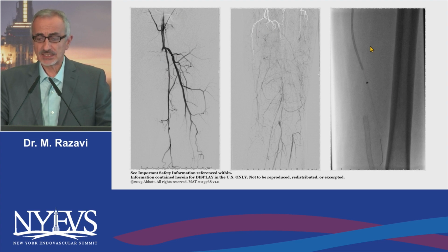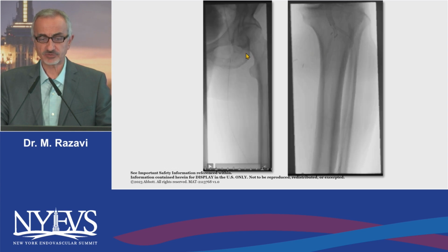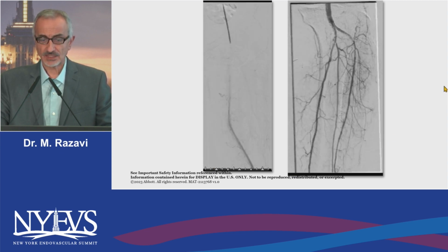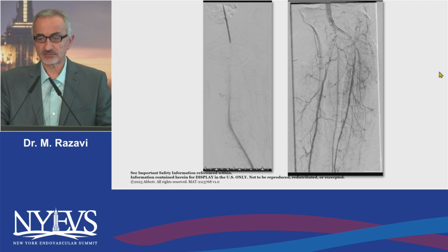Now, when you have a synthetic bypass, when you put this device in there, you don't even have to advance it. It's been our experience that when you get halfway through it, it actually sucks the entire thing in, as powerful as it is. And this couple of passes later, and here's what it looks like. And this is the synthetic bypass just on the table a few minutes later. Very powerful system.